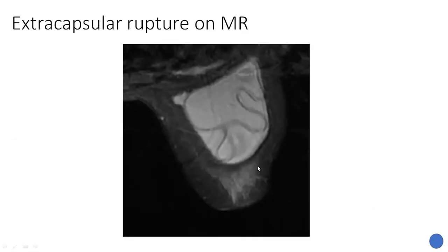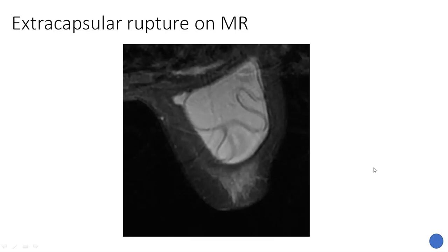Extracapsular rupture on MRI — you need an intracapsular rupture to have an extracapsular rupture. As you can see here, we have a linguine sign suggesting an intracapsular rupture, but also outside of the fibrous capsule — which is this very dark fibrous capsule — we see bright silicone outside of that, which was also dark on silicone suppressed sequences. So this is an example of an intra- and extracapsular silicone implant rupture on MRI.